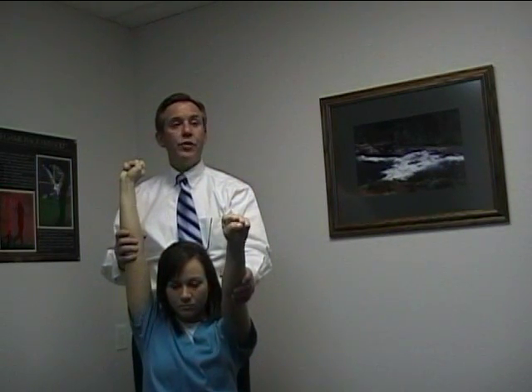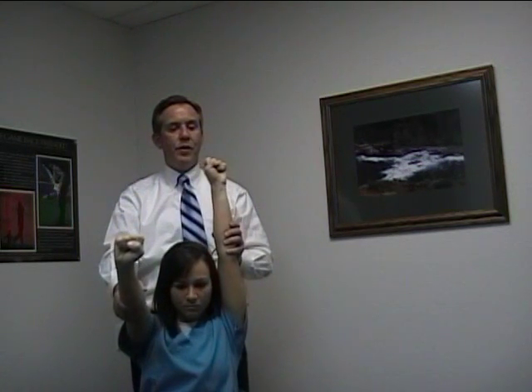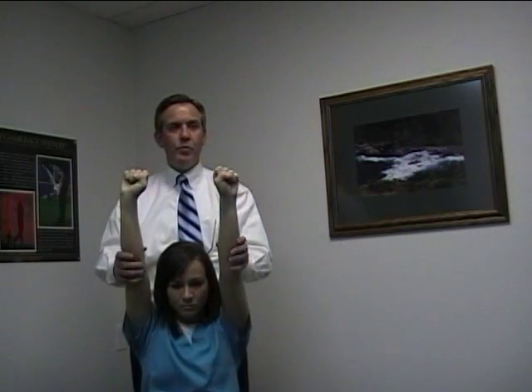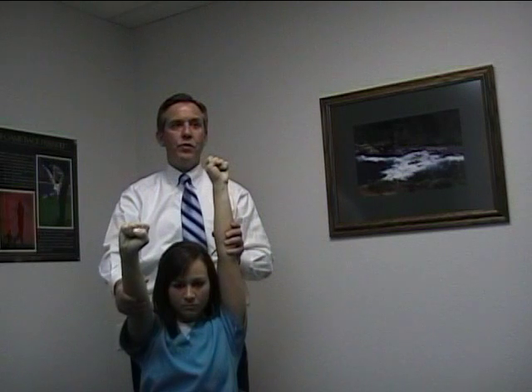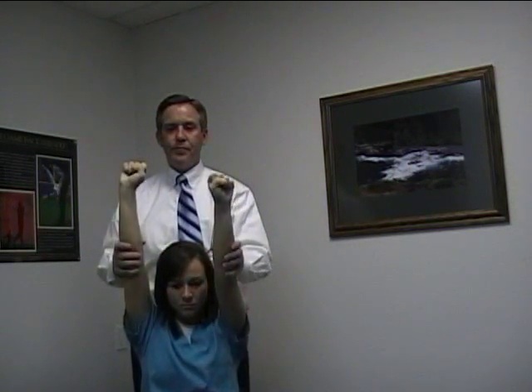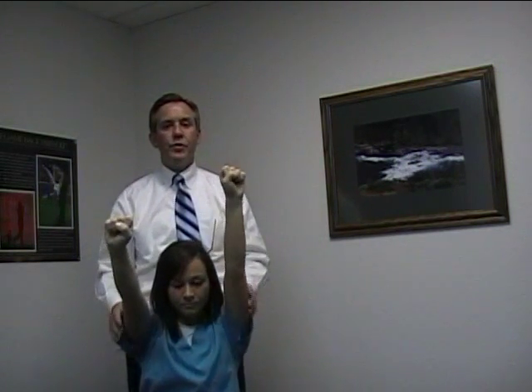And that's the movement. So then when you transition to the shoulder pulley, it's an easy movement for them, if you get them going like this beforehand. That's all the movement. Whether they're stretching or strengthening, this is going to be the movement each time. Okay? Now, if we were going to do the stretching, we would simply turn the chair around and do the exact same movement, except that the arm going up, instead of pulling, is going to be relaxing. And that will stretch the shoulder backwards like this.